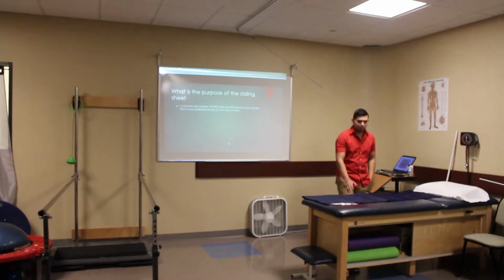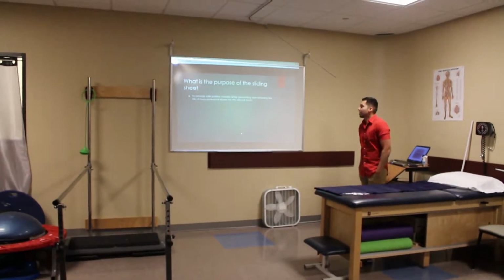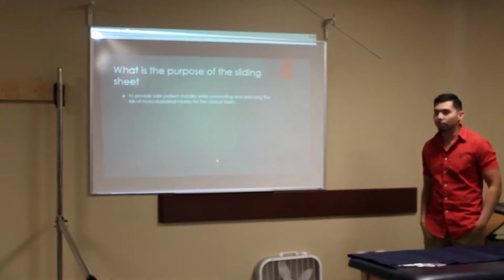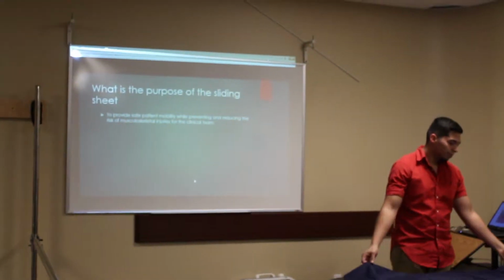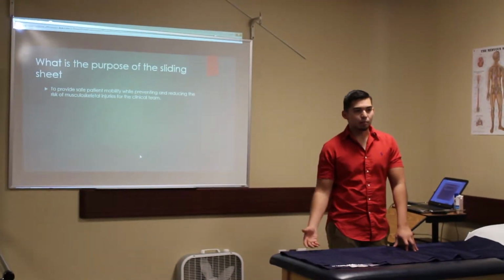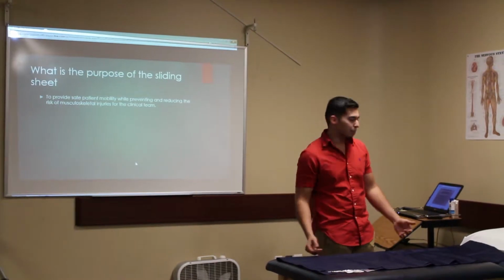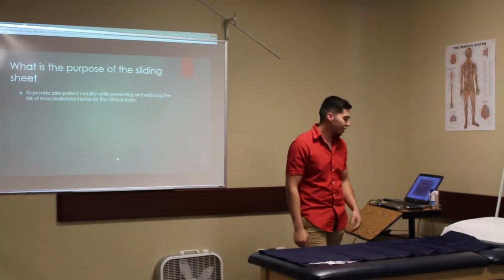So what is the purpose of the sliding sheets? It's to provide safe patient mobility, as well as preventing and reducing the risk of musculoskeletal injuries for the clinical team, like yourselves. Normally when you transfer, you're using your back most of the time, and usually that's where your injuries come from: back injuries from lifting heavy patients.